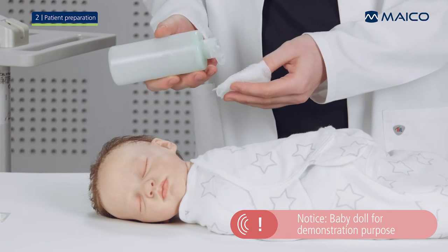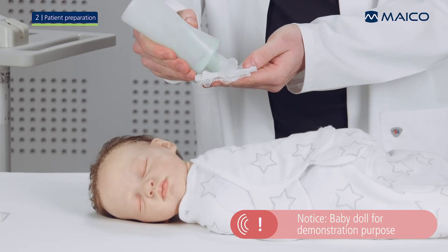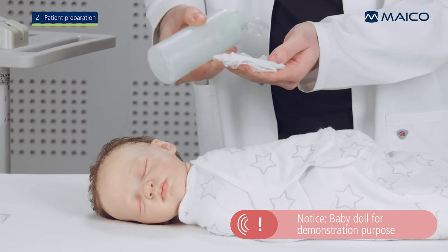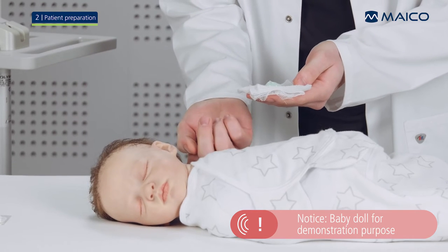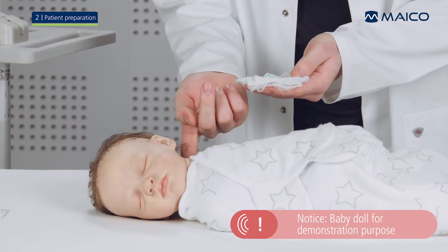Place a small amount of skin preparation gel on a pad. With the tip of your finger, take a drop of the gel and massage it into the skin at the electrode spots. Repeat this for each electrode spot.